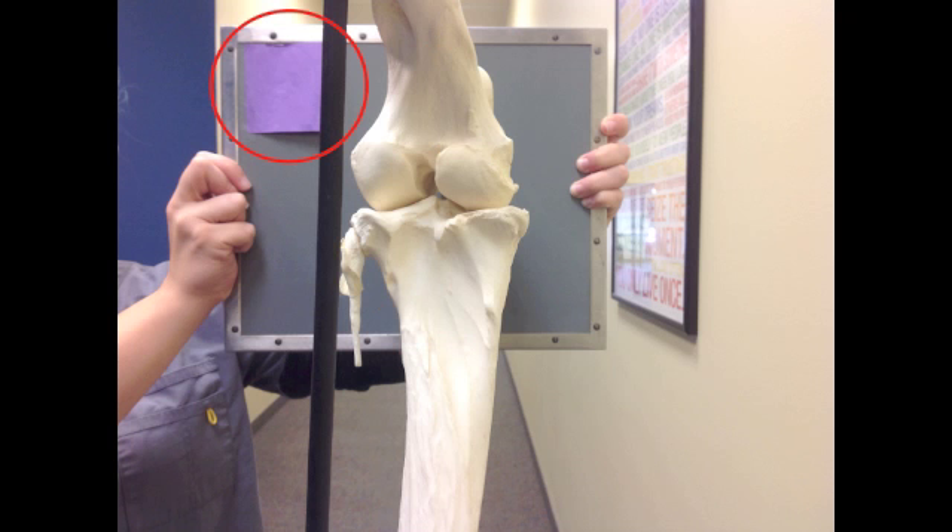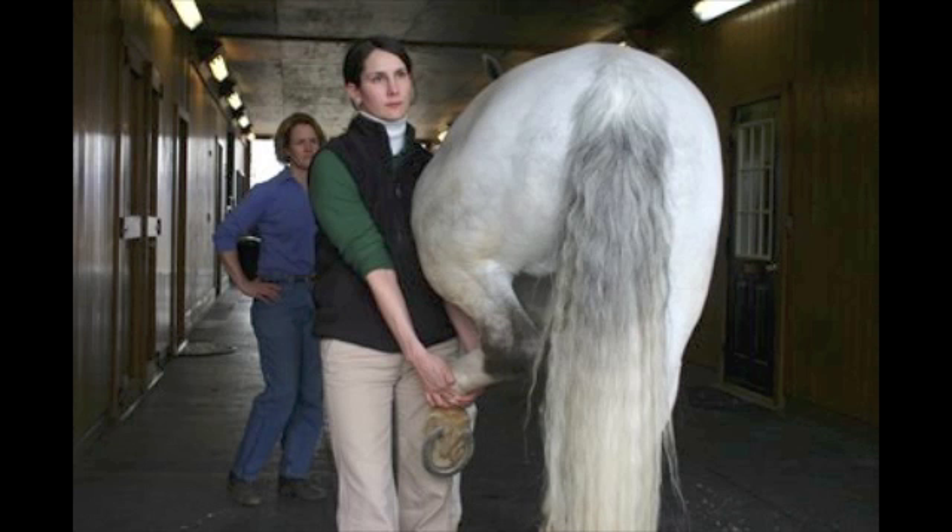Don't forget to place a label on the cranial lateral corner of the cassette. One final tip: for a horse that likes to shift their weight, hold the leg that is not being radiographed in a flexed position, ensuring all the horse's weight is on the leg you want to x-ray.